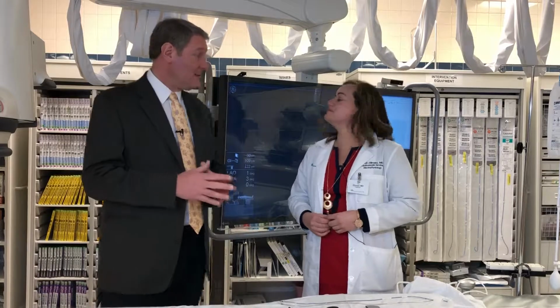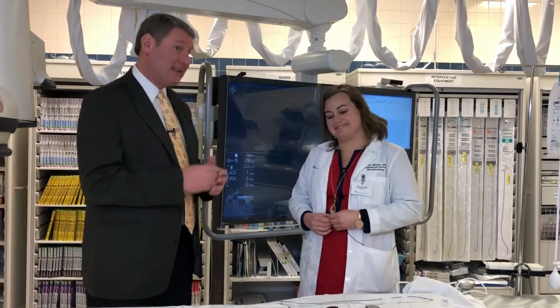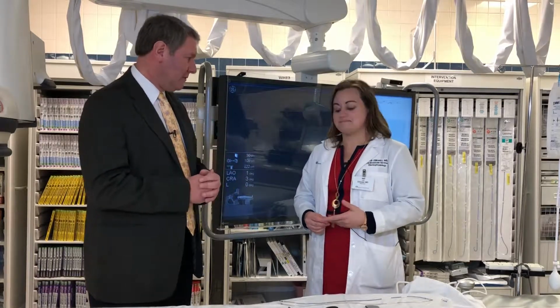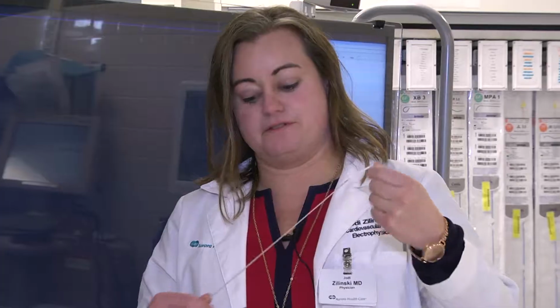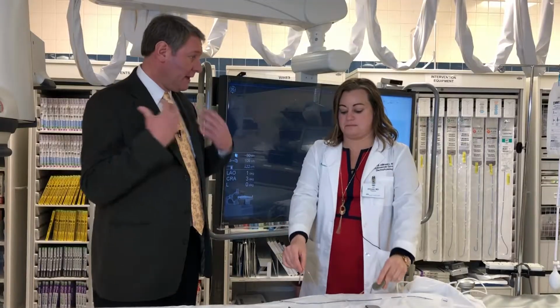Okay, and that's what we want to talk a little bit about today, especially some of the devices and the procedures. So let's talk a little bit about pacemakers. I think that's something a lot of people understand. They've heard what a pacemaker is, but what it actually looks like and how it's used. Sure. So this is an example of a contemporary pacemaker. Reason somebody might get this is that their heart rate is a little bit too slow. So essentially a pacemaker is going to speed it up. This is what we call the pulse generator. So basically it's the battery plus the computers that run it, and then it's connected in the heart to a wire, a lead, basically an insulated lead that sits in the heart and then connects up to the pulse generator itself.